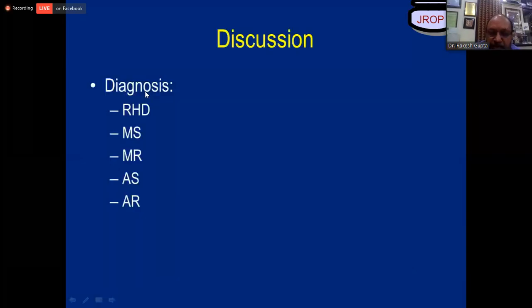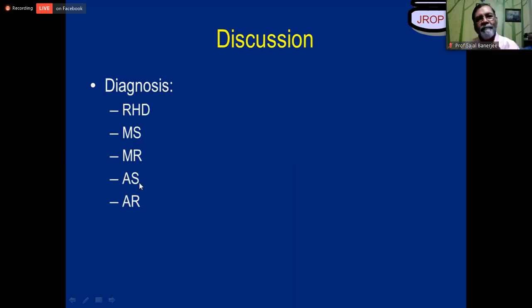My question at this moment is, we can open up a mic, we can say yes or no. The diagnosis, all of us agree, rheumatic heart disease? No difference in diagnosis, because we could see doming, we could see thickening. How about MS? Is the patient having mitral stenosis or not? No. Regurgitation or not? AS or not?